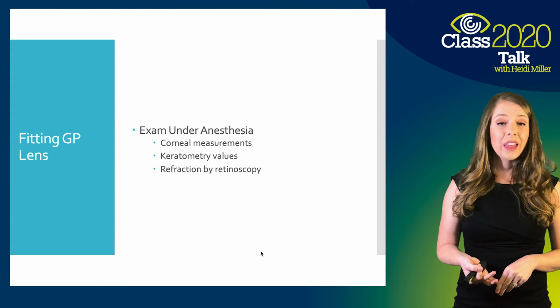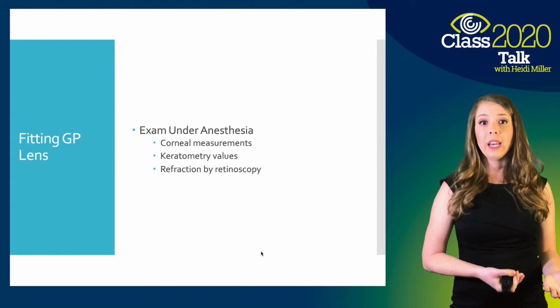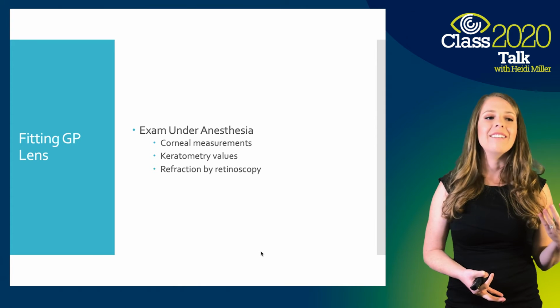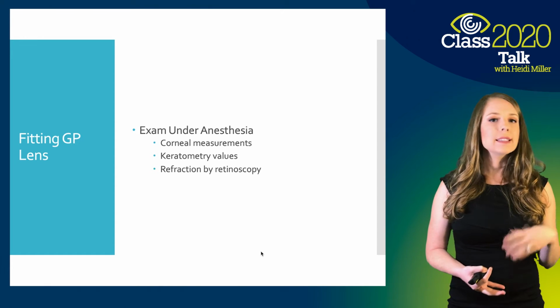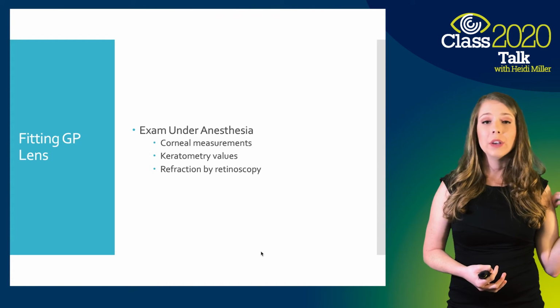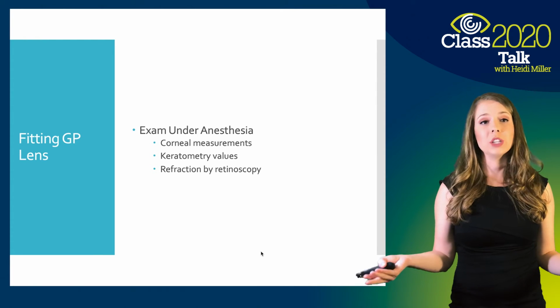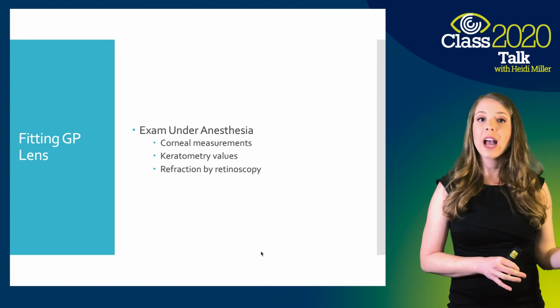When we're fitting GP lenses, not everybody has this luxury. I happen to work in ophthalmology and I co-manage with a lot of the pediatric ophthalmologists. So sometimes I get lucky in that I have exam information from their exams under anesthesia. And sometimes they'll get corneal measurements for me. Sometimes there'll be keratometry values. And sometimes they'll have some refraction that they did with retinoscopy. But sometimes I won't have any of this information. It really just kind of depends on how their exam went and how much time they had.